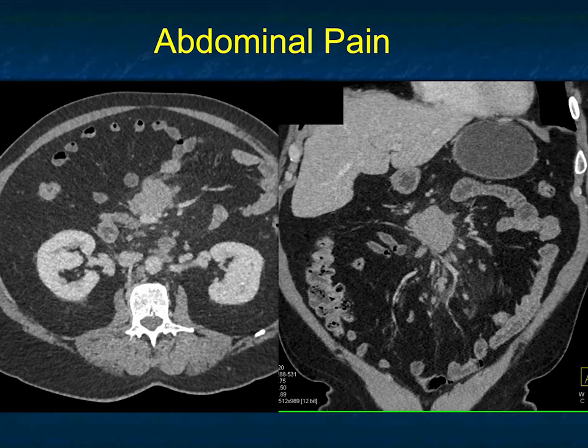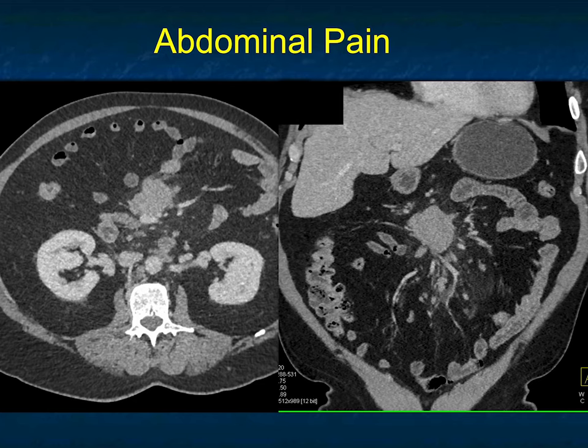In this patient with abdominal pain, there's a solid mass in the mesentery with minimal enhancement, and additional nodes more posterior near the periportal region and in the mesentery. When I see a mass like this in the mesentery, I'm thinking carcinoid tumor and sclerosing mesenteritis. Sclerosing mesenteritis is a benign inflammatory process — greater than 70 percent of the time you'll see calcification. In carcinoid tumors, calcification is also present about 70 percent of the time, but I don't see that in this case.